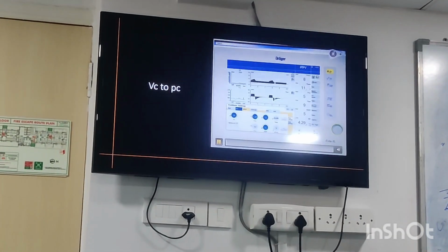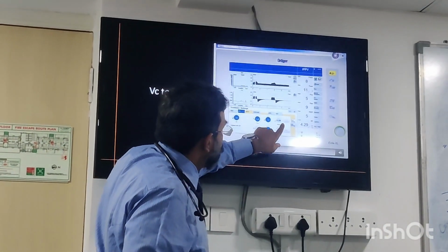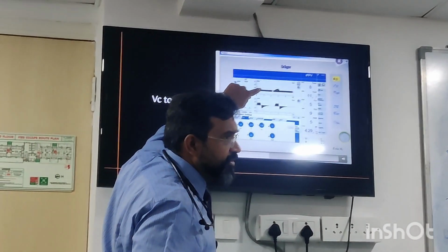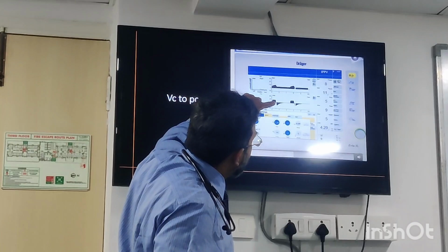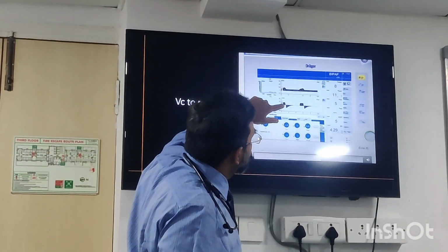Remember this once more. See, this is your time. You have set an I:E ratio here. The I:E ratio is constant. So this is my expiration. My expiration is starting right here, right? Now let's see what happens to the pressure waveform.